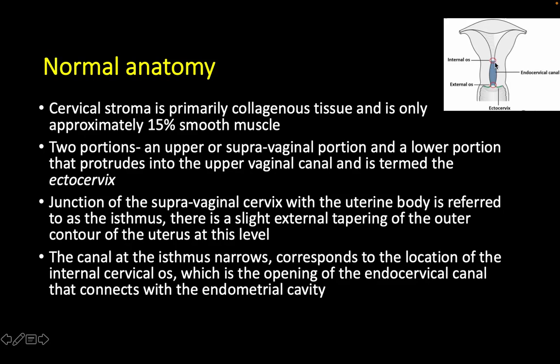So, if we obtain a longitudinal mid-sagittal section of the uterus with the cervix, and we want to identify, especially in a gynecological patient, the location of the internal os, all that we need to do is direct our probe laterally towards the parametrium and identify the level of the uterine artery, which would correspond to the level of the internal os.